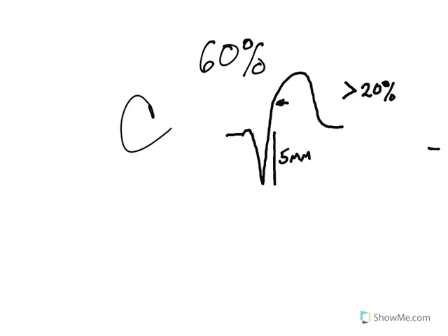So in that case, if I'm talking about a 5 millimeter QRS, then I would be looking at a J point that's elevated, 2 millimeters above the baseline. That would be considered abnormal discordance. Well, that's a problem because remember, when I have that odd depolarization, I have odd repolarization. So that's why Sgarbossa criteria C is only about 60% accurate.